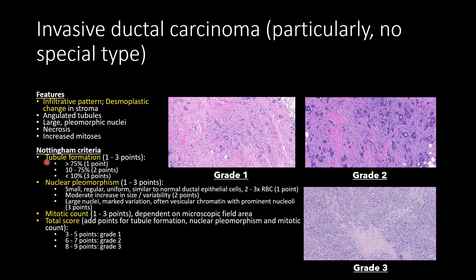Nuclear pleomorphism is difficult to appreciate at this magnification, but generally the larger and more variable the nuclei, the higher the grade. Mitotic count also depends on the microscope field, but more mitoses corresponds to a worse grade. A total Nottingham score of three to five is grade one, six to seven is grade two, and eight to nine is grade three.